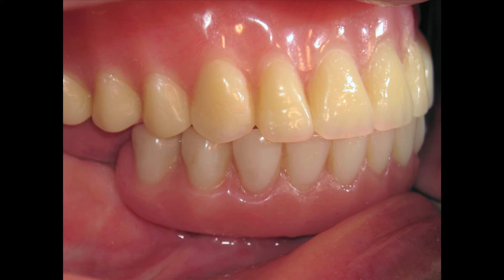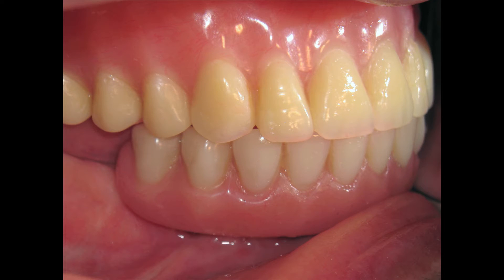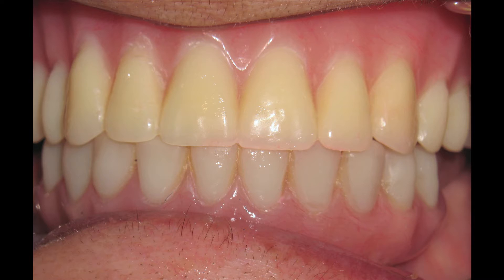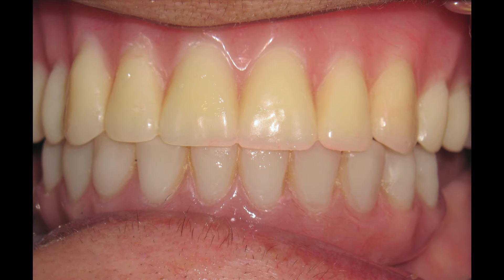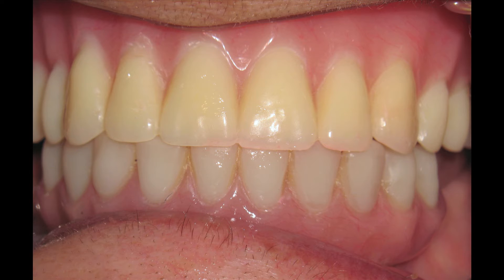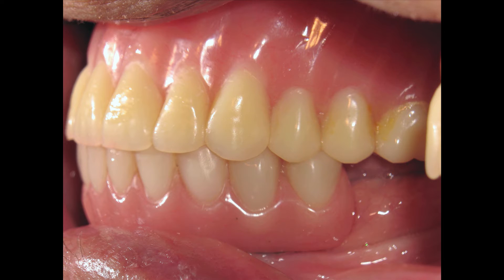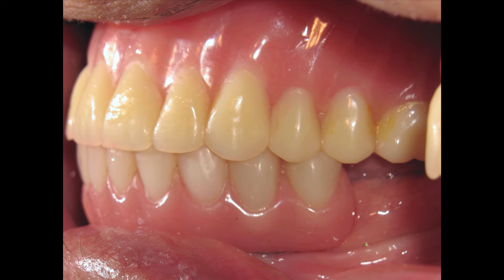The provisional was designed to remain out of contact with the peri-implant tissue, allowing for cleansing, and it did not cantilever past the distal-most implant. This abbreviated design reduced the forces transmitted to the implants even though the patient's provisional prosthesis was opposed by a full upper denture. She was instructed to maintain a soft diet for the first three months, and the implants were allowed to integrate for six months.